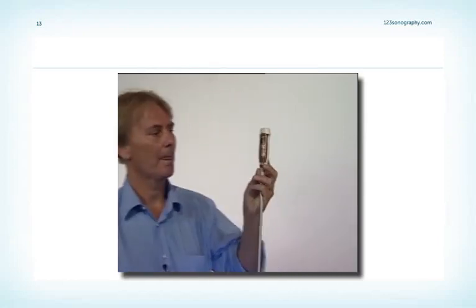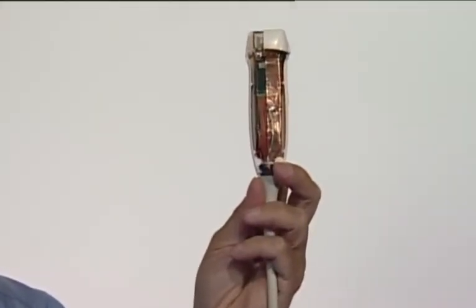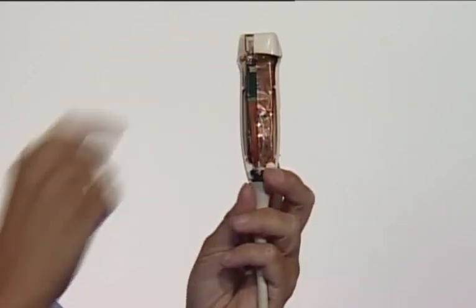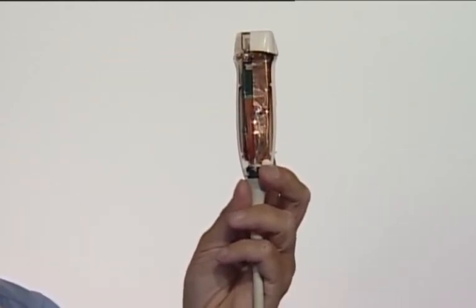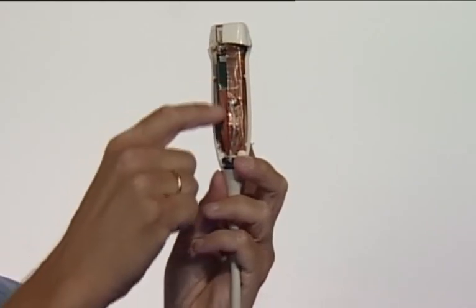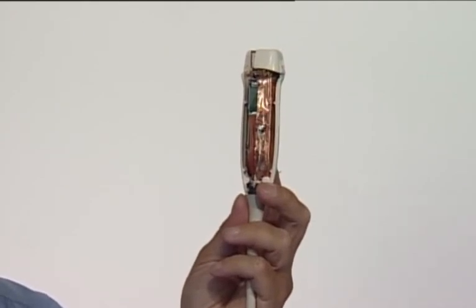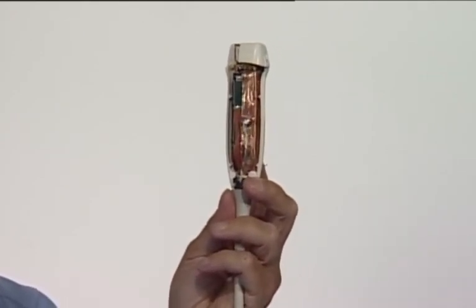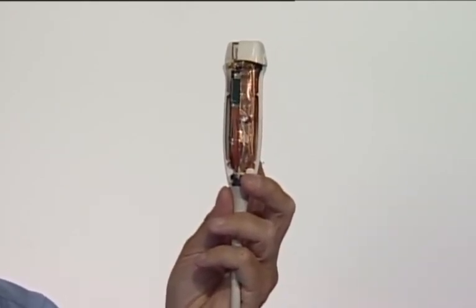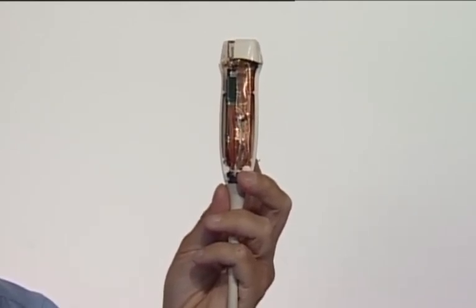Have you ever asked yourself what is inside a transducer? Well, I can tell you. A lot of very thin wires and cables which are attached to the transducer elements which are somewhere up here. You have some dampening up here for the crystals, and then you have all sorts of other electronic elements which honestly I don't even know what they are. But keep this in mind when you have these transducers in your hand, because if you drop them and if they break, they're very expensive.